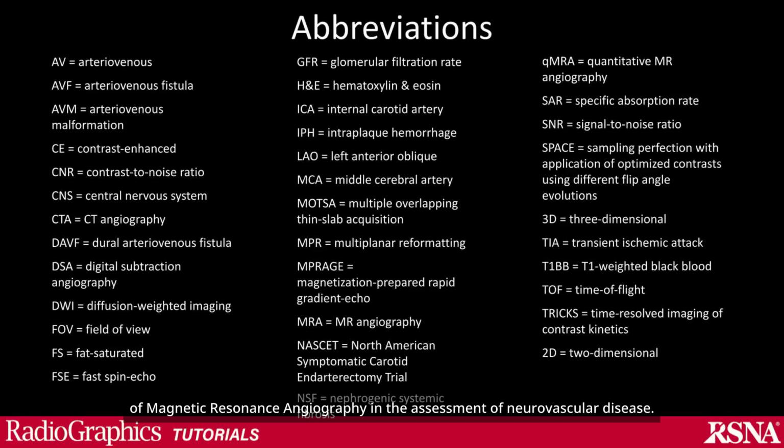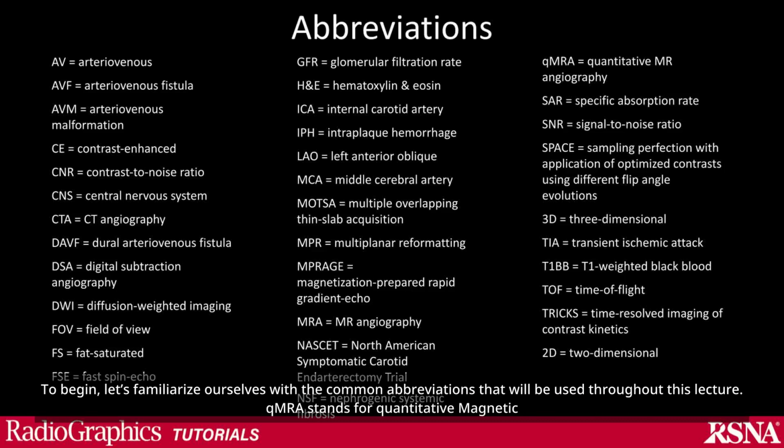Our focus will be on understanding the evolving role of magnetic resonance angiography in the assessment of neurovascular disease. To begin, let's familiarize ourselves with the common abbreviations that will be used throughout this lecture.